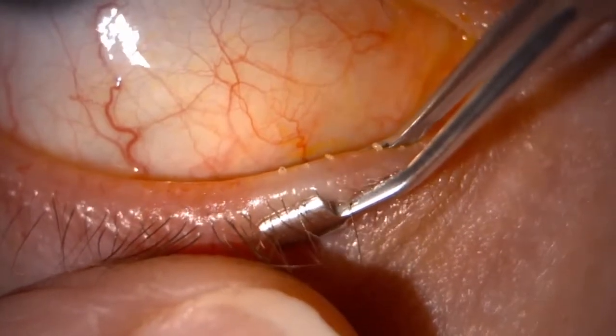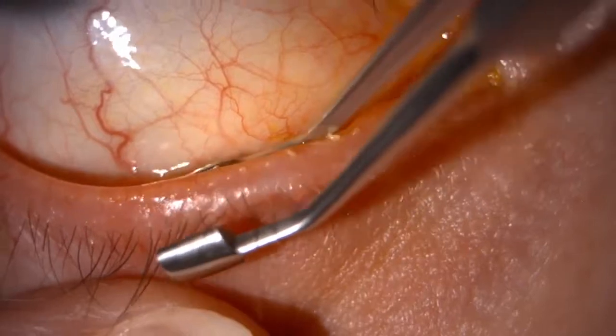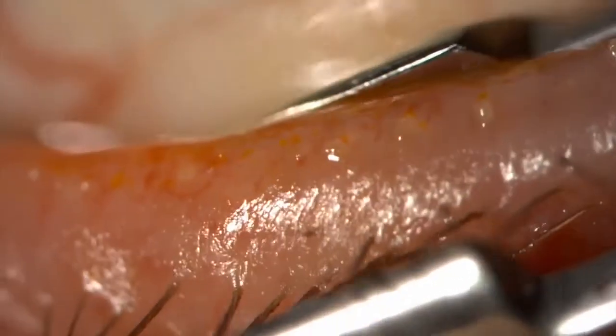You work your way along the lid edge and the lid margin, squeezing the glands with each section. It is important that you try to express every gland thoroughly and that you make sure the patient isn't too uncomfortable as you keep going, guiding it along the margin of the lid.